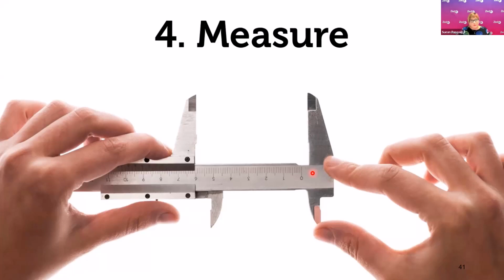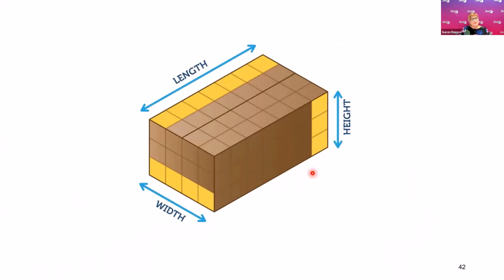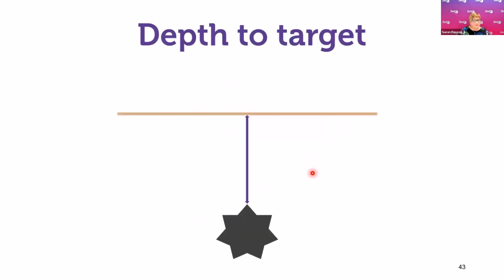And once you've found the foreign body, the next step is to do some measurements. So what we need to establish is the length, the width, and the height of the foreign body. So we'll take a length and a width, if we can, in the longitudinal plane, and a height measurement, a length and a height in the longitudinal plane, and a width measurement in the transverse plane.